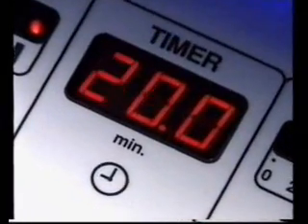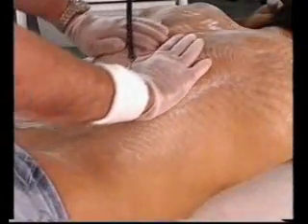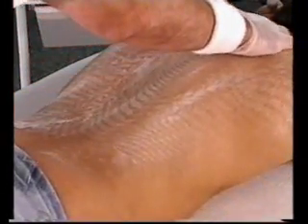Therapy time depends on the state of the tissue and its change during treatment, as well as on the size of the area undergoing treatment. Normally, acute tissue conditions require shorter treatments of 10 to 20 minutes. Chronic states, however, call for longer therapy of 20 to 30 minutes.